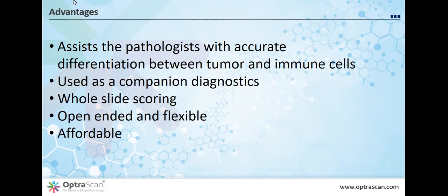These algorithms could be plugged in to the software and could be used at any point of time. And again, this tool can be hosted, as I mentioned, on the cloud or locally on the laptop or computer, and could be used by the user at any point from any location. On the last slide, we've also included our contact details. So in case you'd like to know more about these algorithms or would like to request a live demo, we'd be more than happy to accommodate that request for you. So let me actually switch my presentation to the contact details slide.